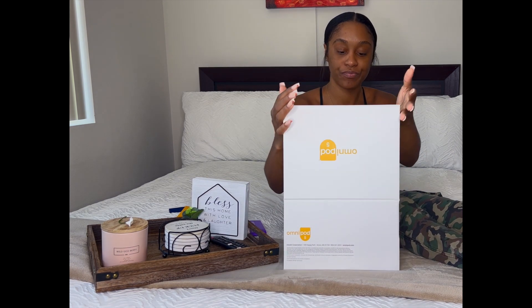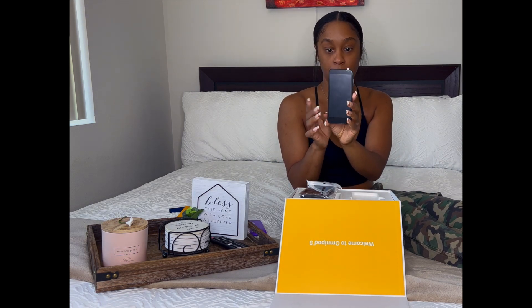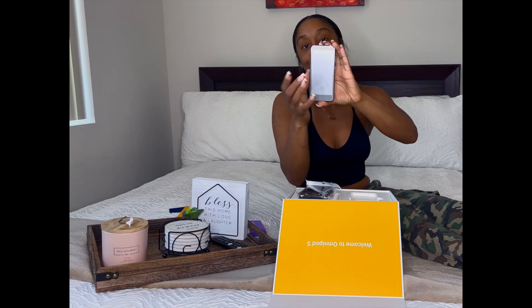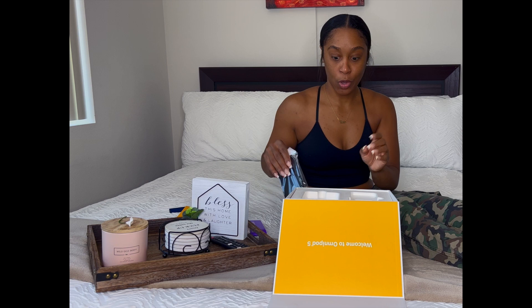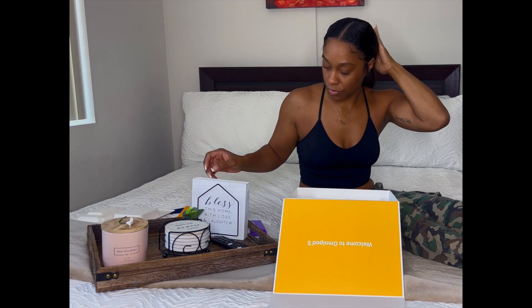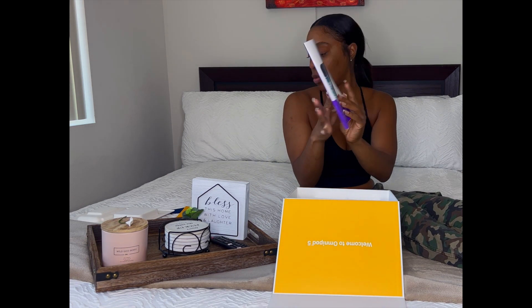So here we go with this big humongous box — the OmniPod 5, the wireless insulin pump. It comes with this cell phone, which is literally an Android — you can see that it's Android — and it comes with this little cute case that goes with it.